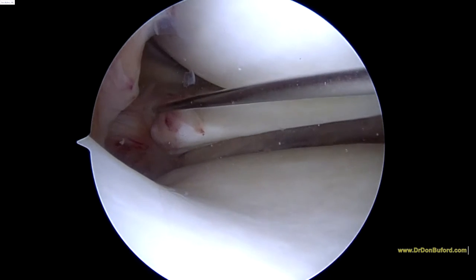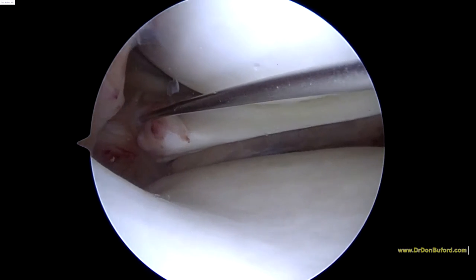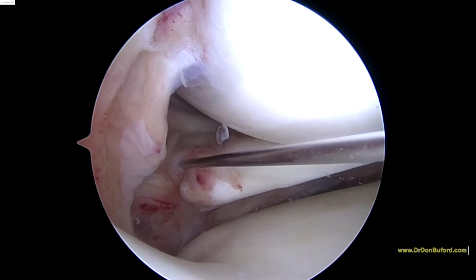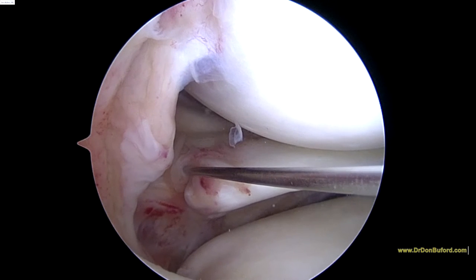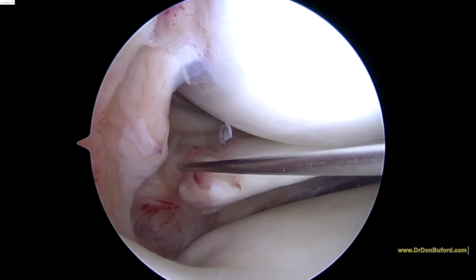We're starting right at the root of the meniscus. We're going to put just maybe a half cc of our BMC injection here. You can see how it swells up a little bit.